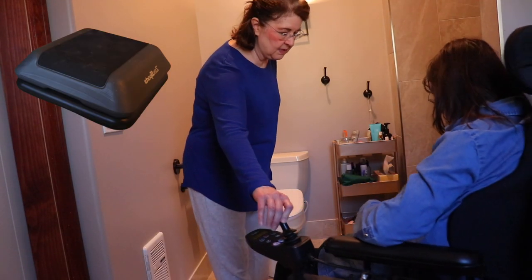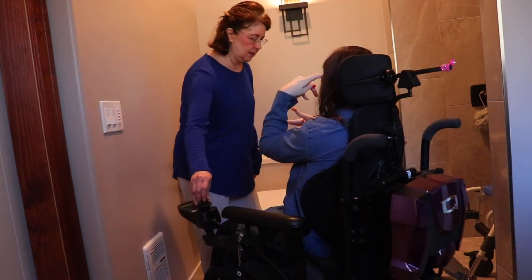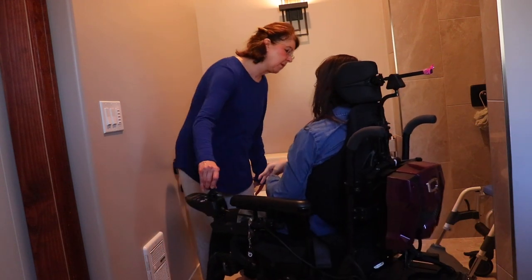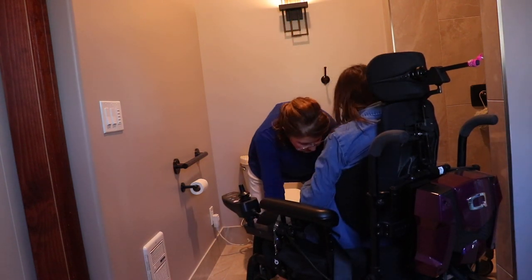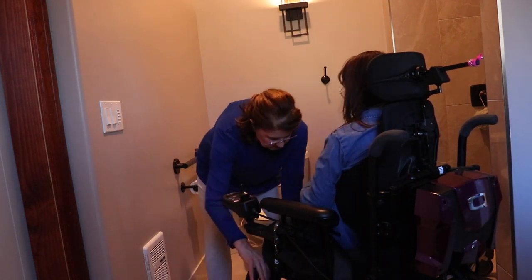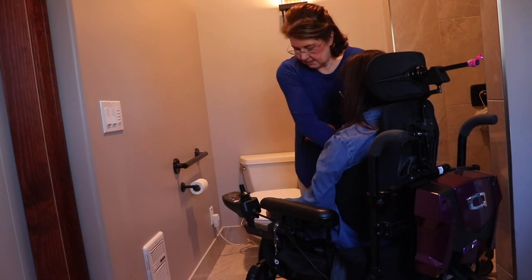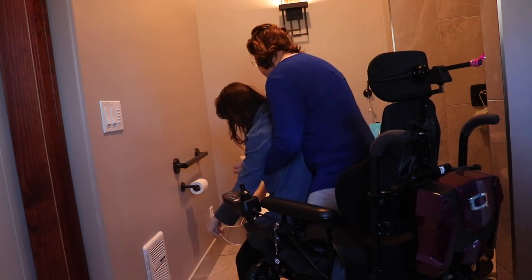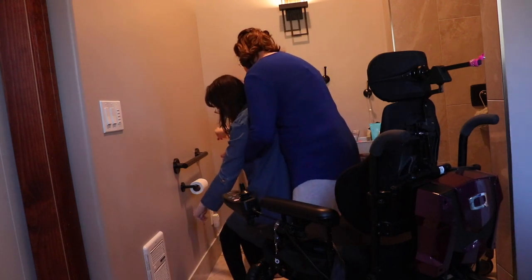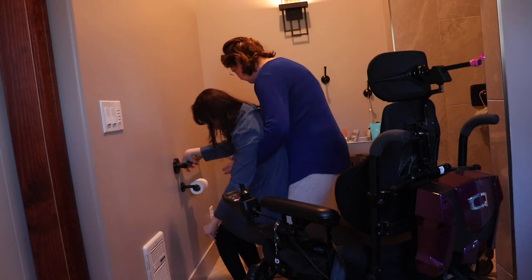With that, I'm going to roll to the bathroom transfer. You can do it that way but I find it easier this way — it doesn't matter for me either, so I go with whatever works at the time. It depends on how bad I have to go to the bathroom; sometimes we go super fast. I put up the footplates and move them. Ready — slide out, one two three, and take steps towards the bar. She can do side steps but not backwards, and then we would pull down everything, lift up the lid, and put her on it.